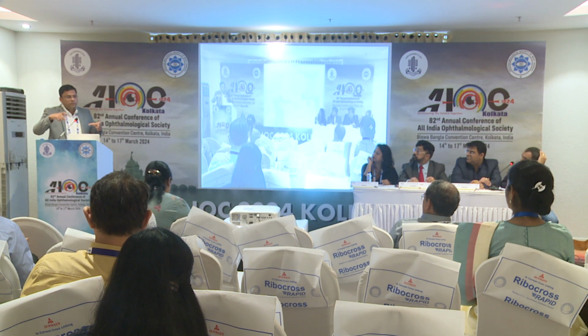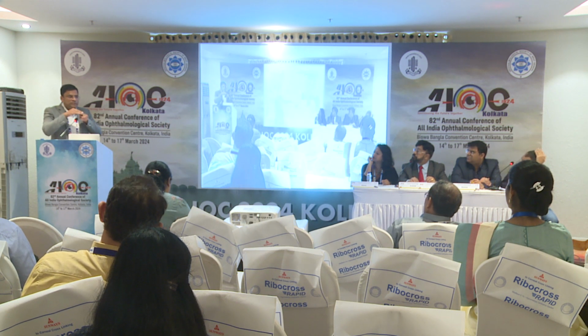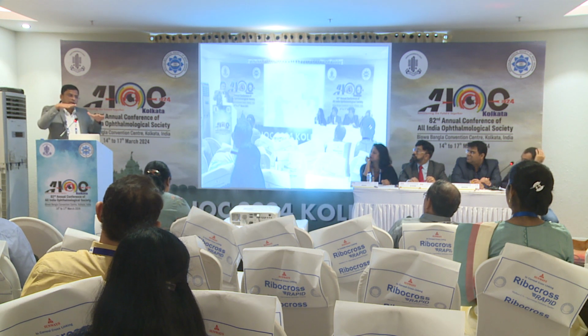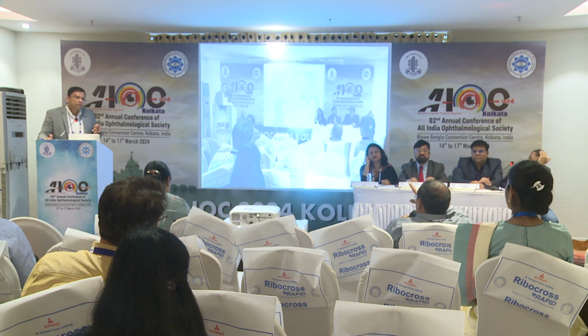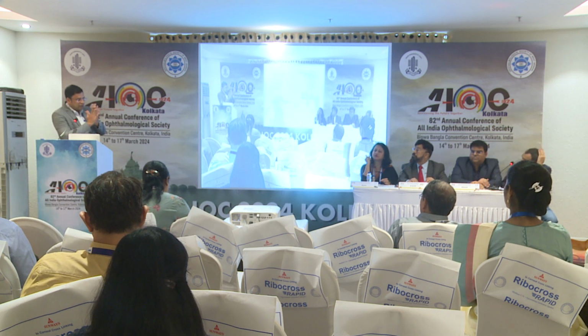So probably because of that, I measured from the limbus 3 times. Every time I would mark, measure and make sure it was the same so that there is no tilt on either side. But one thing, this iris would also probably have prevented the tilting of the eyeball. That would have been an additional anterior stability. Exactly, right. It had an anterior scaffold which prevented movement.